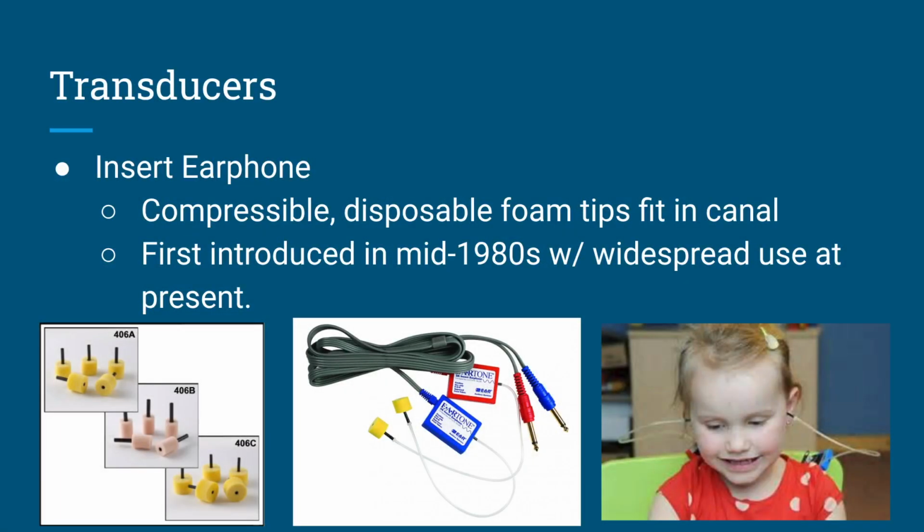Now I want to talk about the different types of transducers. First, we'll talk about insert earphones. These are the compressible, disposable foam tips that fit in the ear canal, first introduced in the mid-1980s, with widespread use at present.